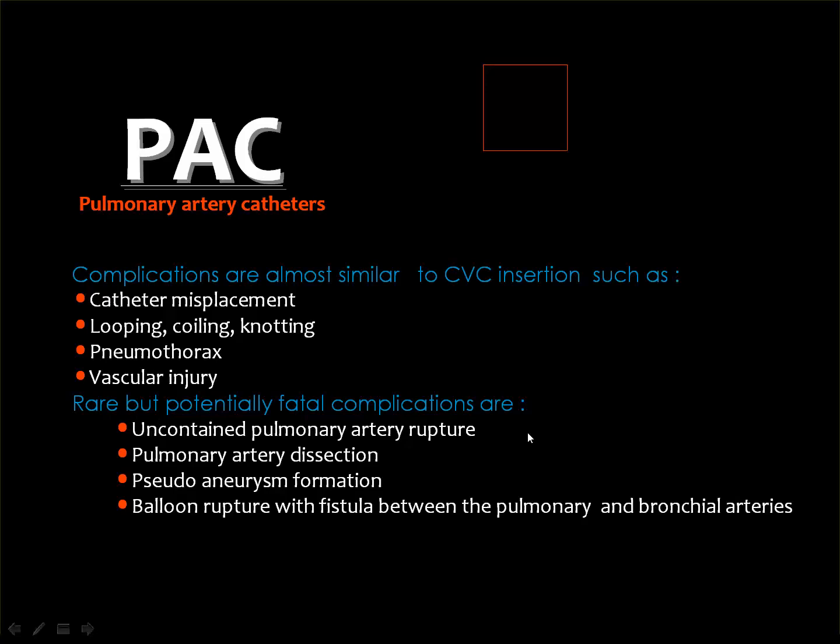And these are considered rare complications, but they are potentially fatal, such as the development of pulmonary artery rupture, pulmonary dissection, and the development of pseudoaneurysm, or a rupture of the balloon of the catheter with development of pulmonary and bronchial artery fistula.